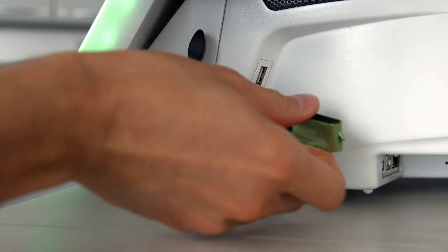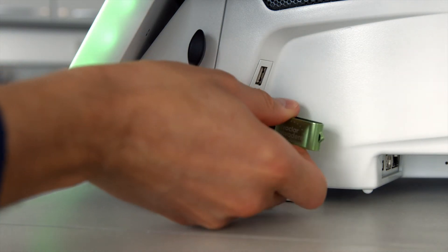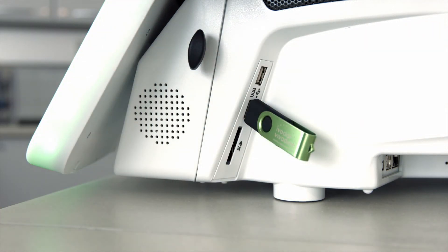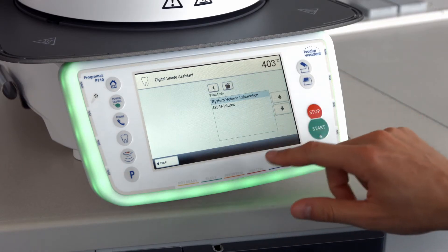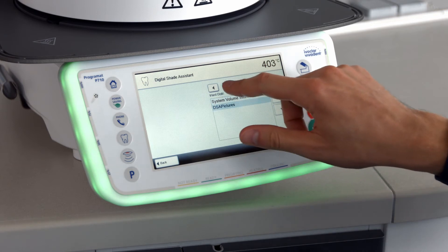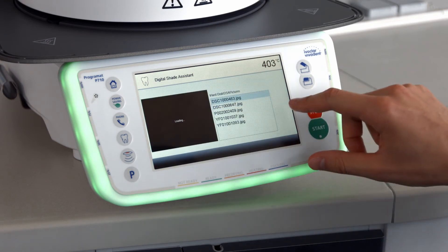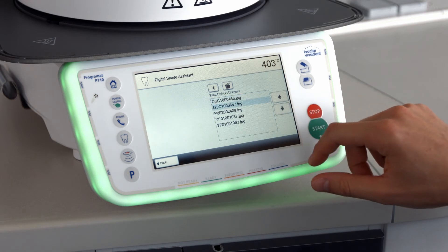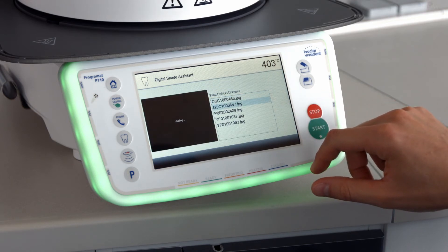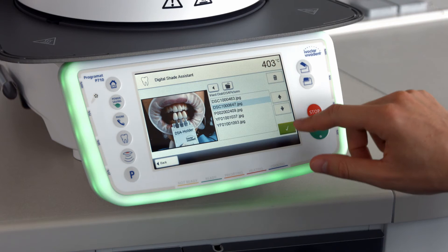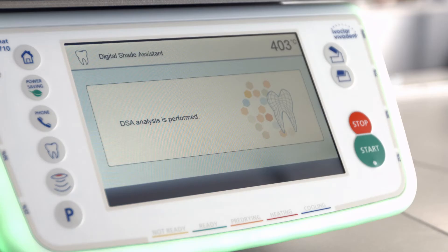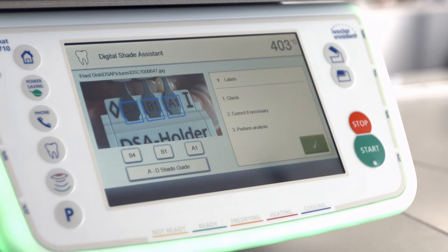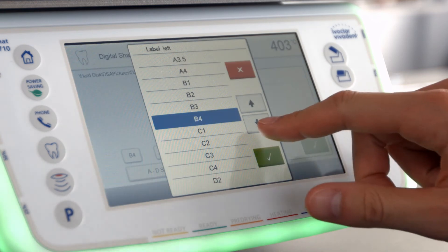Let's assume that the photographs are saved on a USB stick that is connected to the furnace. Begin by pressing the external memory button. Open the desired folder and select the correct picture by using the arrow buttons. You can see a preview of the photograph on the left side of the display. Press the green button to analyze the picture. Analysis will now begin. If the software cannot automatically read the shade labels on the reference teeth, you can select them manually.